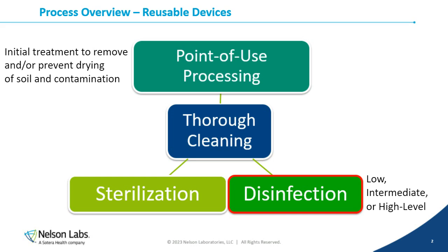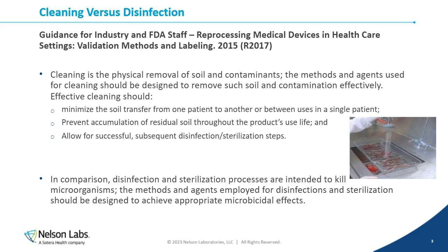So you might be asking yourself, what is really the difference between cleaning and disinfection? Why do I have to do both validations? Are they not the same process? And that's an excellent question. And the FDA guidance document that was initially published in 2015 and revised in 2017 gives a pretty great definition for each of those processes.